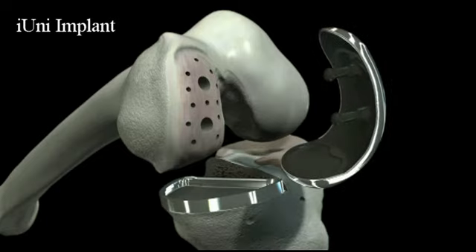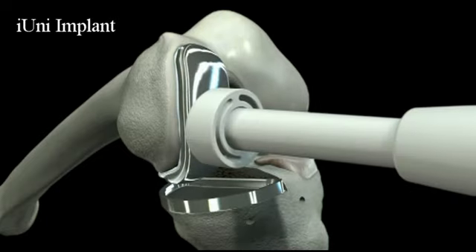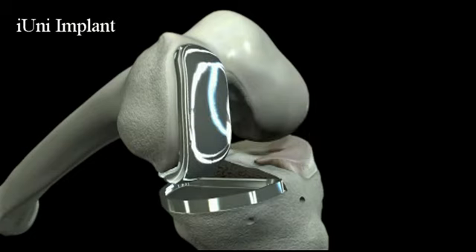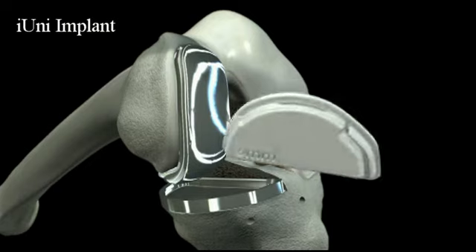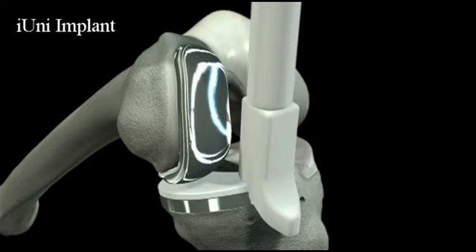Apply a layer of cement to the femur, filling holes and covering the bone surface. Impact the femoral implant using the femoral impactor tip. Insert the selected poly size, posterior end first, at an angle. Finish by snapping the poly into place, by pushing down on the anterior edge with the heel of the tibial impactor tip.